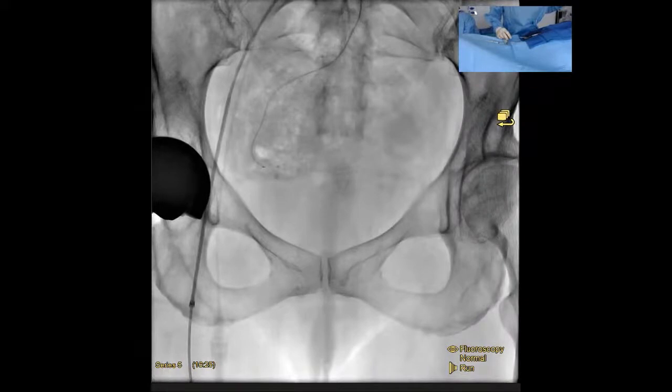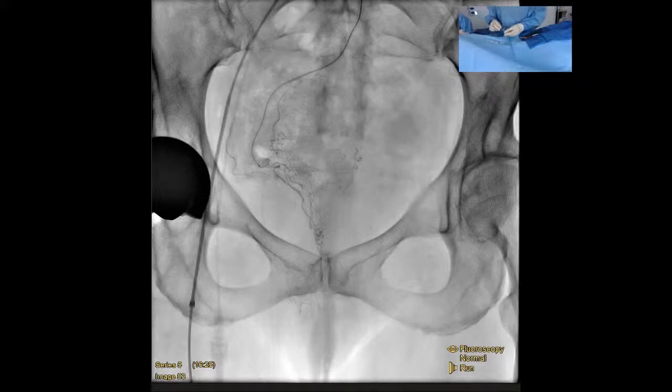We can see distal to the anastomosis. Exactly. Well, not even so much. If we can go distal to the anastomosis, great. In this case, you can see there are just so many small channels to get past. But if we can, it might be nice to get beyond that first loop into the vertical segment of that artery. Right. So, we call that the corpus cavernosum recti.